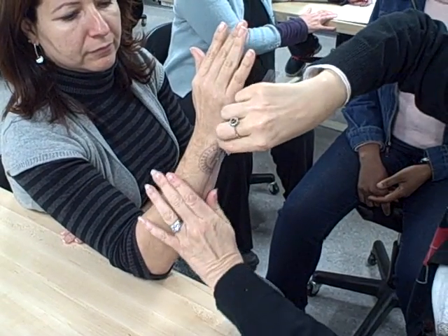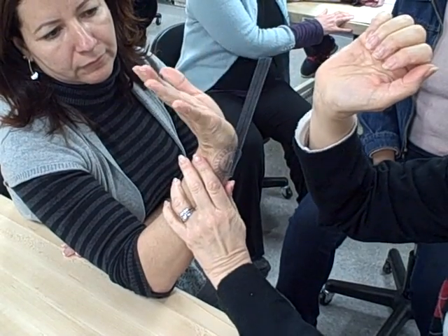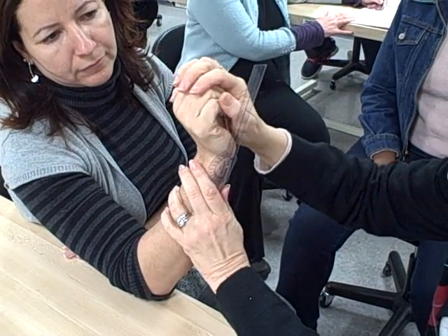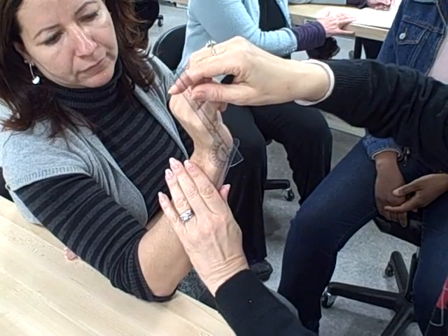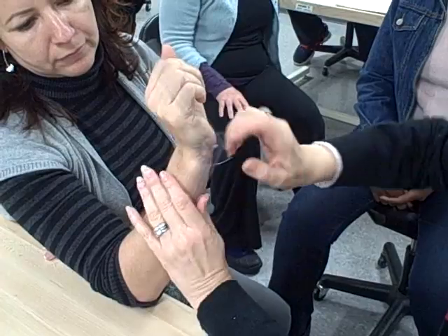We can line the goniometer up with the fifth metacarpal — let your hand come back, let your fingers be bent — where I'm using the fifth metacarpal and the ulna.